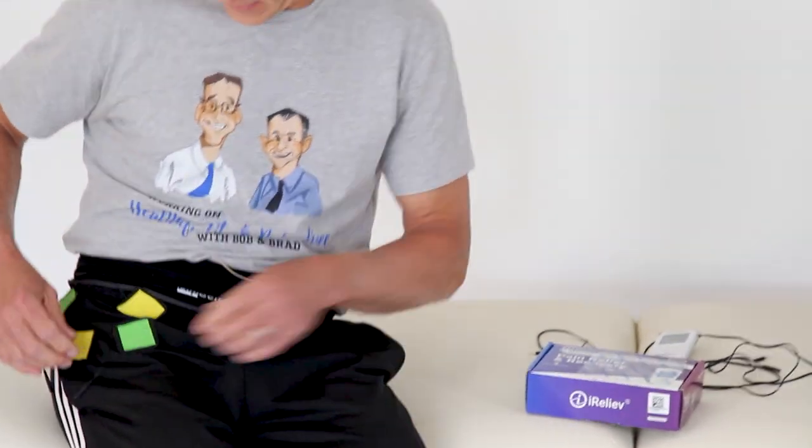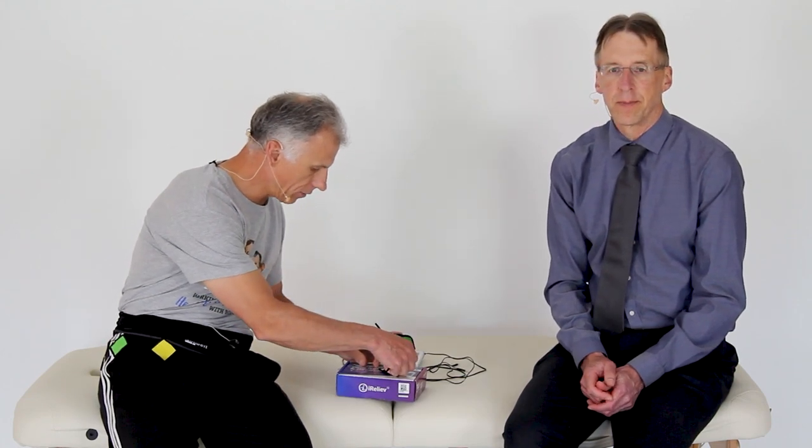They don't stick as well anymore. Yeah. You'll be able to tell because it just doesn't feel right. Yeah. It's kind of a weird tingling instead of the tingling that you want. Yeah, exactly. And that's just a matter of working with it.